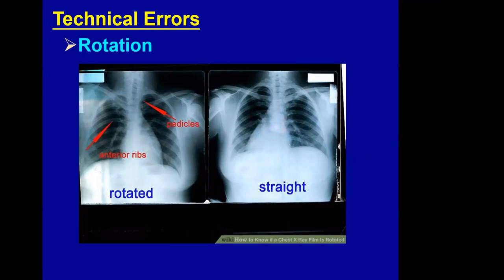Looking at the comparison films, note that one is placed backwards — the cardiac shadow should be on the left rather than the right. This is another thing to watch for when reviewing a radiograph on a view box or digital display.